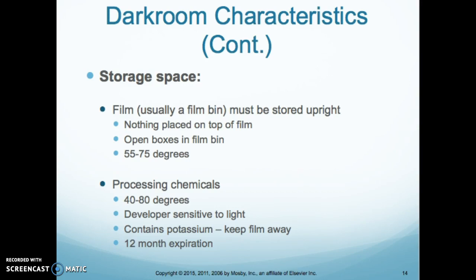So your chemicals are going to be between 40 and 80 degrees. Your developer is sensitive to any kind of light. You need to be careful on disposal of your chemicals. They contain hazardous materials within them. We can't just dump it down the sink, and they are usually good for about 12 months.